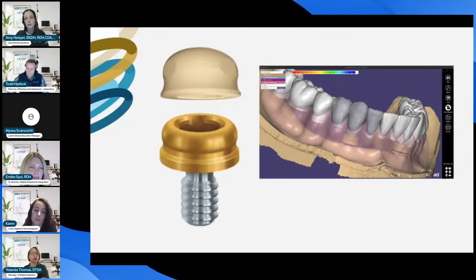When you look at the image on the right and you see that scan of the denture, and you look under that canine, you can see that that's where the scan body is. That's what your scanner and your software will work on finding, the position of that locator abutment. These are the records that Leixir is going to talk about tonight and what they need to help fabricate that prosthesis. But all the scan body does is snap onto the locator abutment and allow the scanner to capture the position of the locator.